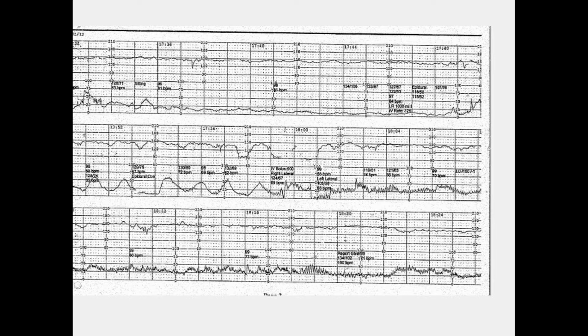Okay, good. And then here's that little section I pulled out for you earlier with that variable but now late. Look what happens. And what are these? Lates, right? And they're deeper and they're worse, right? So when you see a pattern like this and we start to see some lates developing, and the fetal heart rate tracing I pulled up right before this course had that in it, that one that's on our floor right now, it's a very, very big warning sign, okay?